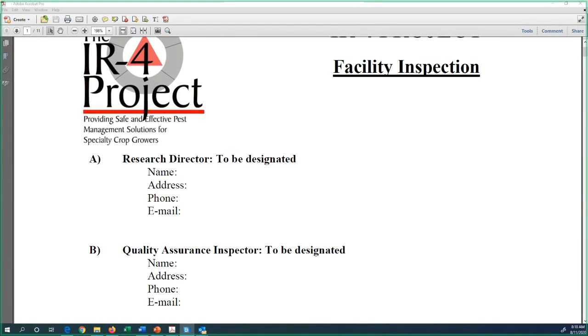If you make the change, you need to get approval from the study director, from the registrant, or even sometimes EPA, which is very picky on this. Don't take my word exactly, but we had a few occasions talking to EPA to change the calibration from solvent standards to matrix-matching standards.